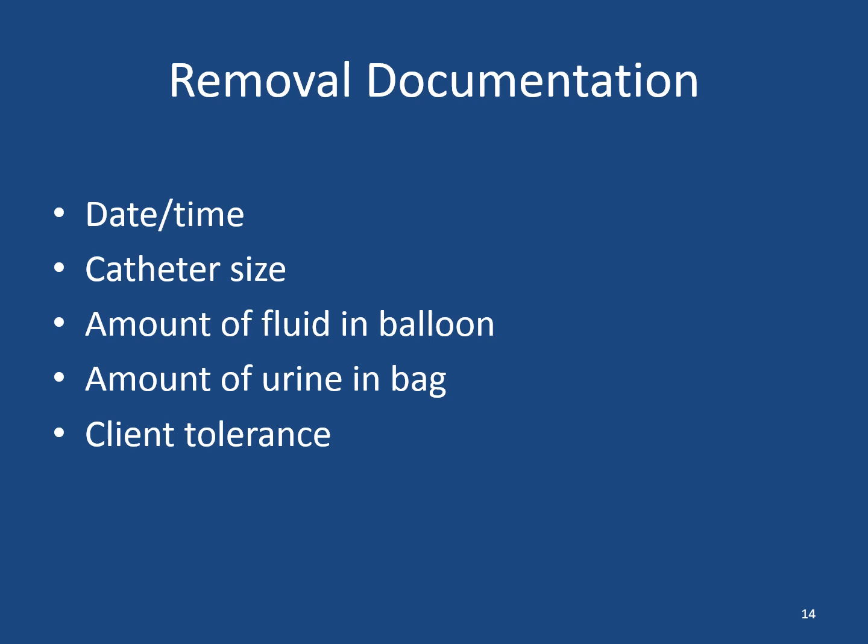When you're removing it, I highly recommend you place a towel underneath the client, or at least something to catch any urine. You have a washcloth in your non-dominant hand. You're going to end up attaching an empty syringe. You can alcohol prep the adapter piece to hook up to the lumen. Alcohol prep that, hook up an empty syringe that's clean, obviously. Allow it to pull back the solution naturally. You don't want to pull on it because that'll create some of those ridges that we talked about earlier.